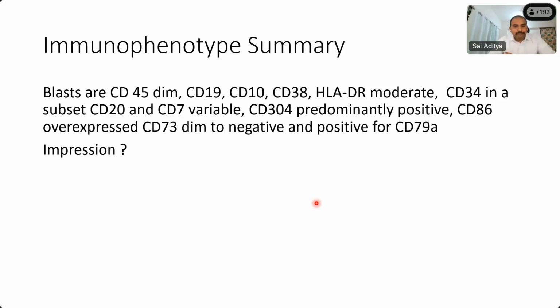In lymphomas, usually they are CD45 positive, bright positive. And CD34 in a subset is also noted. Then they would be usually uniformly positive for CD20. Because CD20 is an IHC marker for B-cell lymphomas generally. So CD20 uniform positivity will be there, a variable positivity is there.